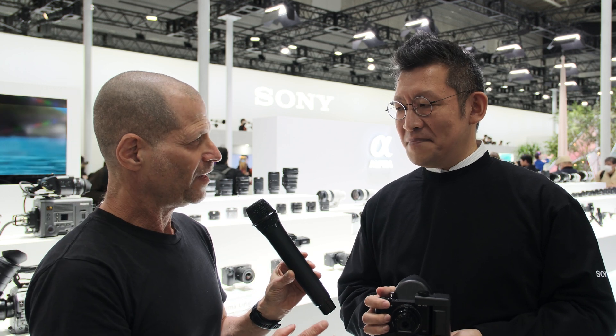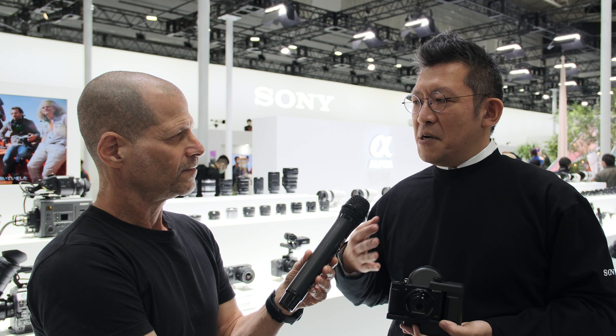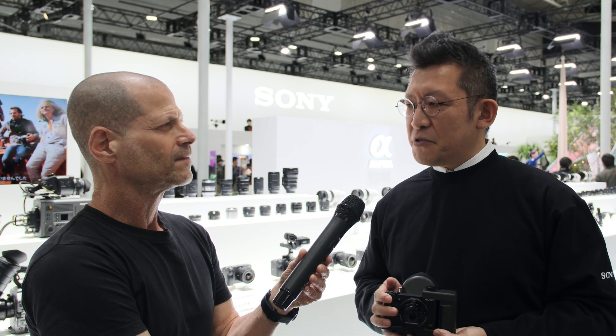We are at the Sony booth, but you are not from Sony. Where are you coming from? I'm actually from QD Laser. That is a semiconductor laser originally founded in 2006 as a spin-off from Fujitsu Corporation. But after 9 years, in 2015, we started to develop a retinal projection product.